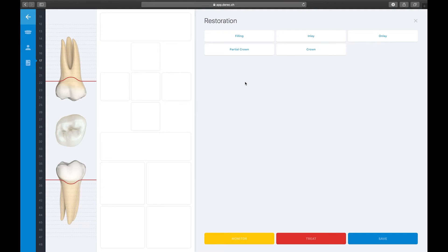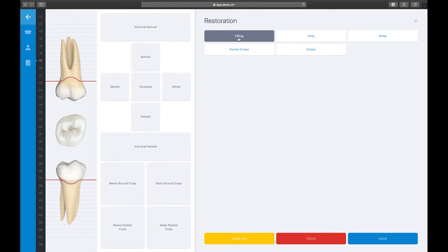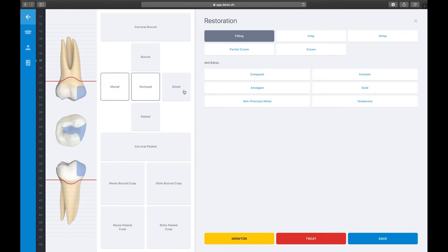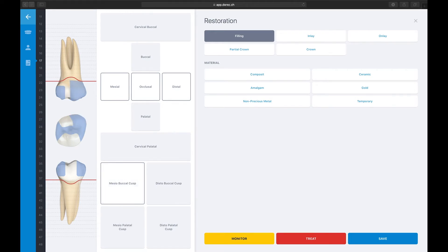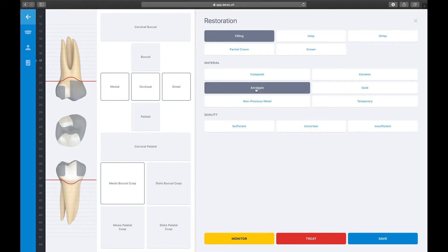Adding a restoration or pathology to the tooth is really simple and easy in Derek. In the single tooth view, press on the Add Restoration button. Derek will switch to the tooth pad for entering data. The tooth pad was designed like a keyboard and shows you only the options you need for entering the restoration, giving you the opportunity to navigate light-speed quickly through the menu structure. In this example, we will enter an amalgam filling to tooth 17. Select Filling on the tooth pad, then select the tooth regions — for example, mesial, occlusal, distal, and the mesial buccal cusp — and choose Amalgam as the filling material.